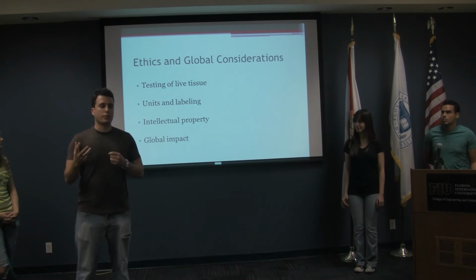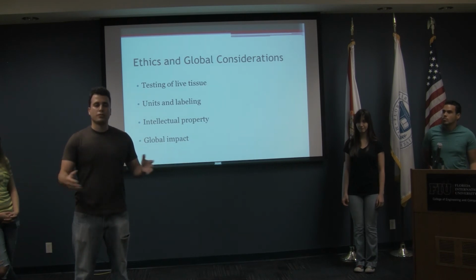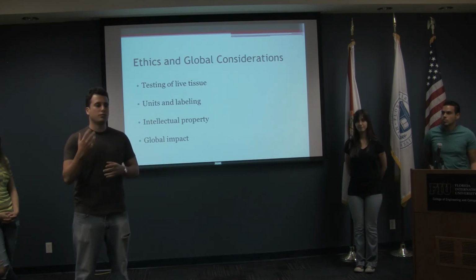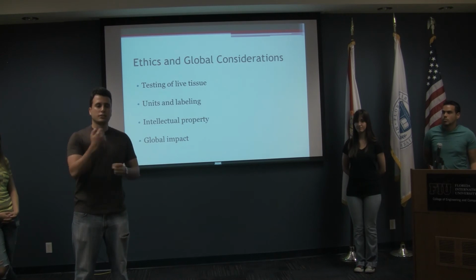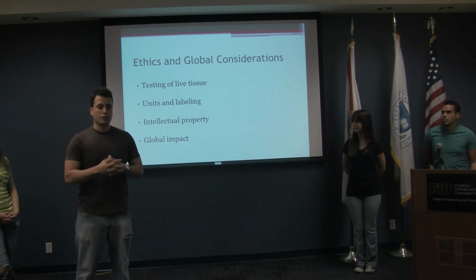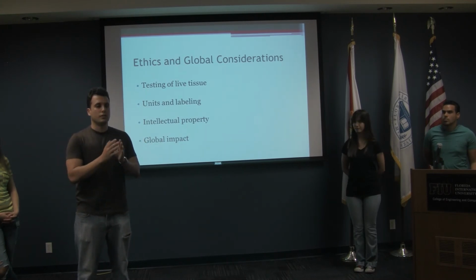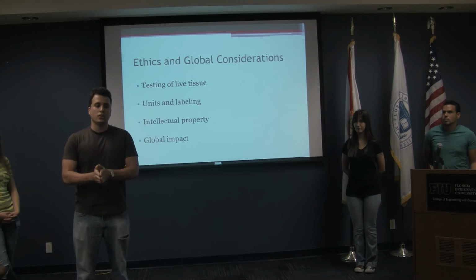Also, since the purpose of this project is to extend how long a heart will last, that means that more regions will be open to receiving such a heart in time for transplant. These regions may have different languages, labeling methods, and units, which we will also take into account. Again, this is a global project because if we can double the amount of time that a heart can last, we can almost double the amount of people that could be saved.